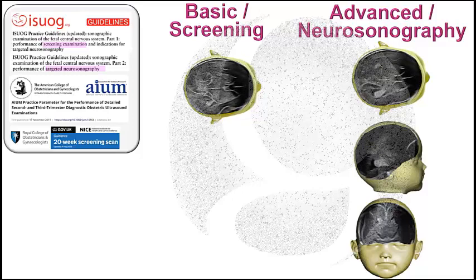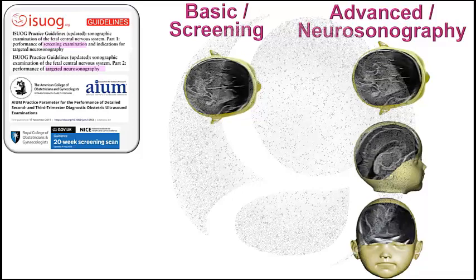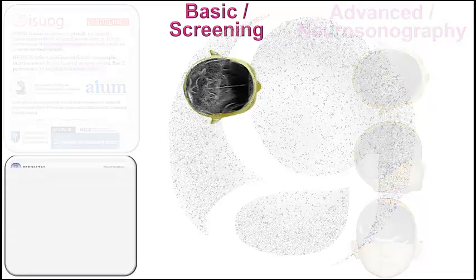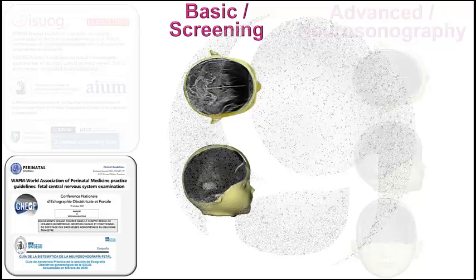However, in recent years, other guidelines are arising in which they include the mid-sagittal view in the basic or routine exam for the direct visualization of the corpus callosum. In the Spanish guideline, the mid-sagittal plane, although not mandatory, is mentioned as advisable in the basic exam.